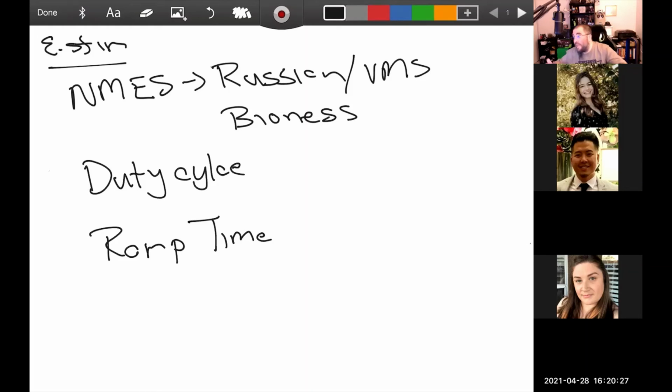Yeah, so the longer the ramp time, the easier it is on the patient. It takes longer to reach that full contraction. But the longer the ramp time, the less they spend in full contraction. Does that make sense? So ideally, 2 seconds is kind of the most ideal ramp time. I tend to do 1 second with most of my patients because I'm mean. But 2 seconds is typically what you're going to see. So you can adjust the ramp time if patients can't tolerate it. The duty cycle is one of the more important ones.